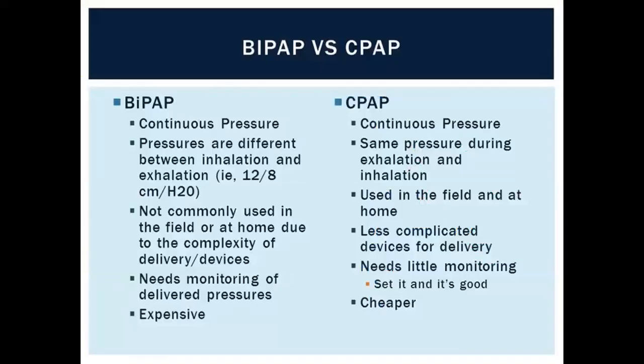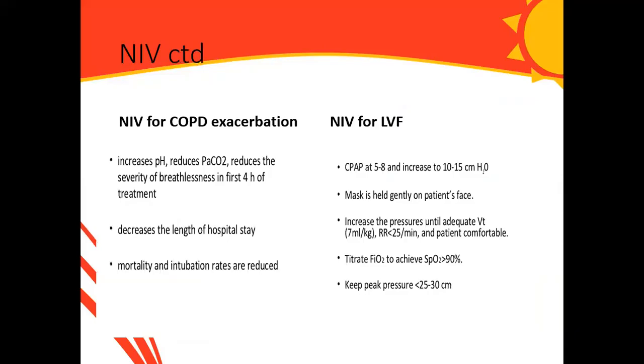So if you are asked what is the difference between BiPAP and CPAP, I'm sure you can just produce it for me. Like I said before, non-invasive ventilation can be used for exacerbation of COPD, and this is a slide to show you how it is done. Also, non-invasive ventilation is used for left ventricular failure, especially complicated by cardiogenic pulmonary edema.